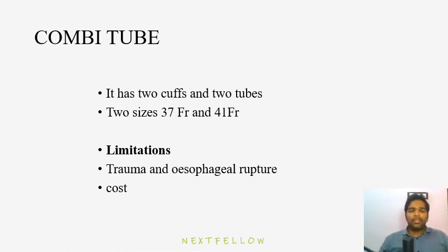Now the limitations are trauma, esophageal rupture and cost. It is also costly and it is also used in the field. Most patients with head injury may bleed into the mouth and you won't know where the bleeding is coming from. So people are afraid to use this, and that is why it mostly went out of practice.